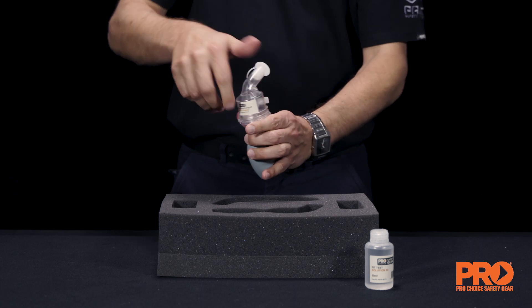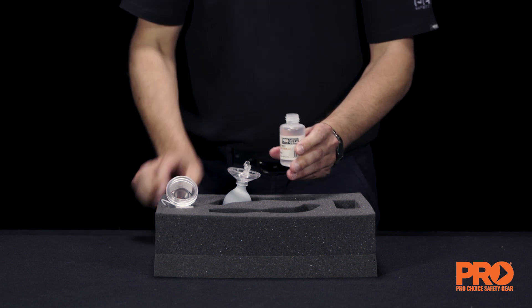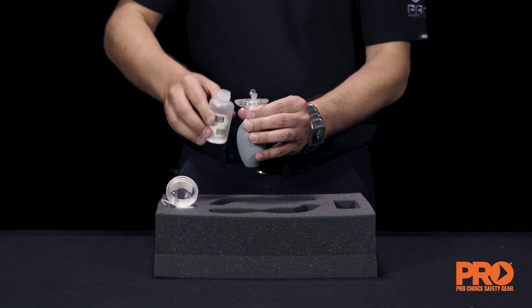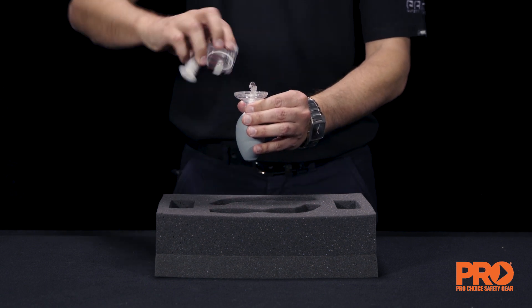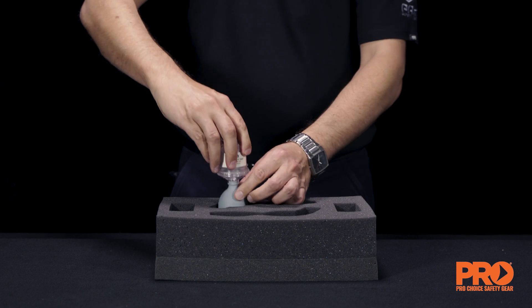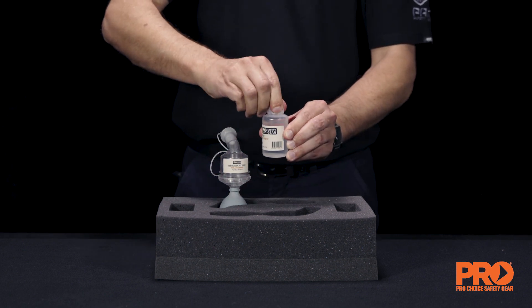Gently remove the lid on the nebuliser unit. Pour a small amount of sensitivity solution into nebuliser number one. Pour the same amount of fit test solution into the second nebuliser labelled number two. Immediately recap the solution bottles and nebulisers.